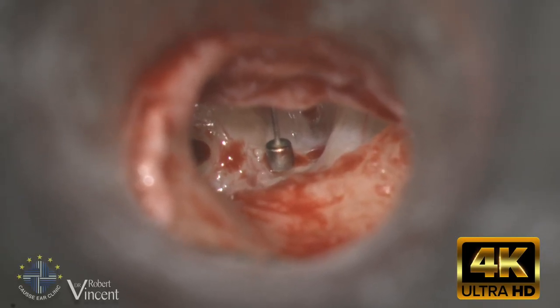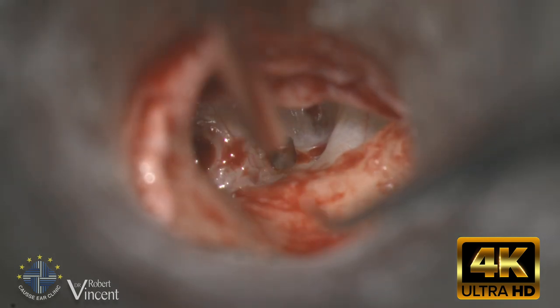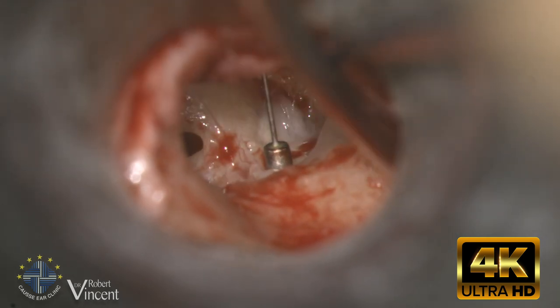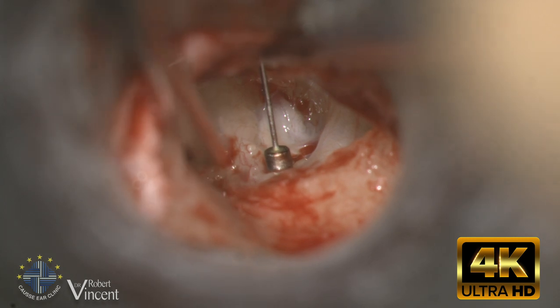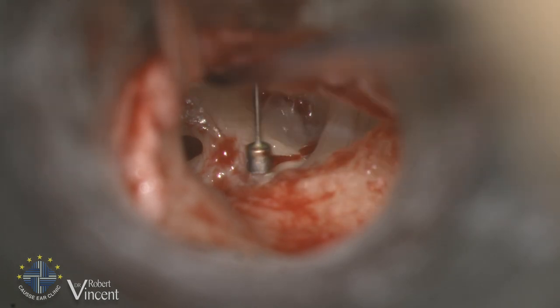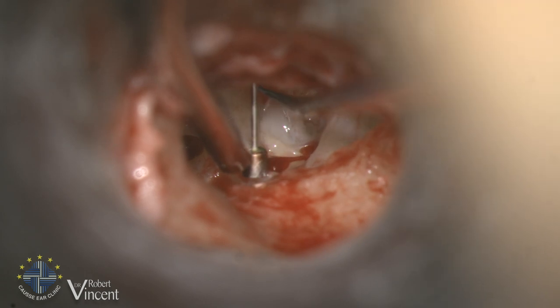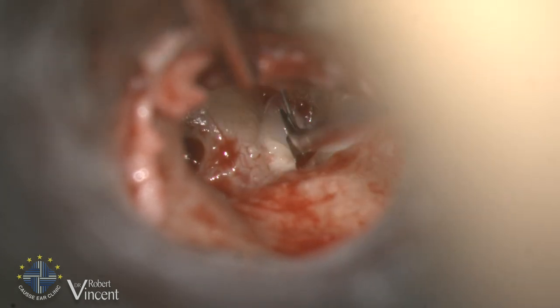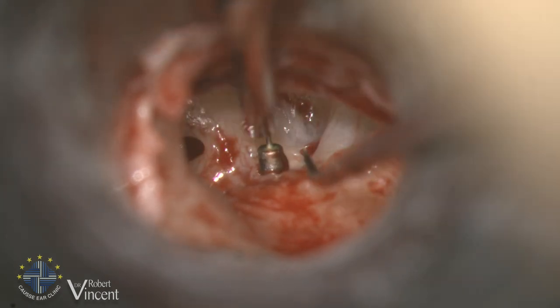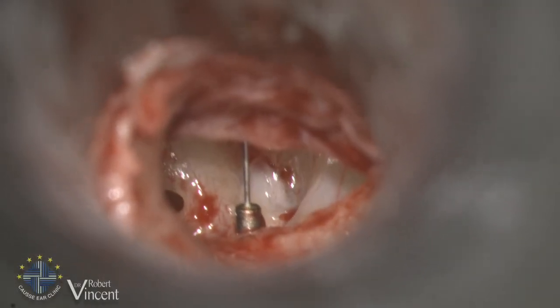This is the left ear revision tympanoplasty — several previous surgeries, at least three or four. There are no more residual ossicles. You can see the facial nerve on the right, and there is a TORP which was used by the previous surgeon. It is dislocated, still connected to the tympanic membrane but very loose and a little bit short. We need to remove that.